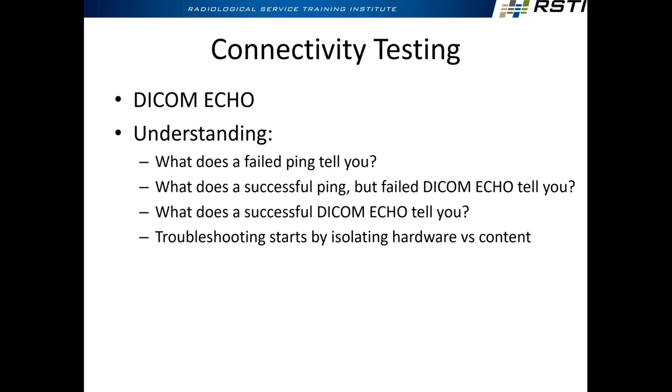Understanding ping and echo. What does a failed ping tell us? Hardware problem. What does a successful ping but a failed echo tell you? Software configuration. What does a successful echo tell you? Your communication is configured right. You have configured them right. Yeah, exactly. If it fails beyond this, now we have a content problem.